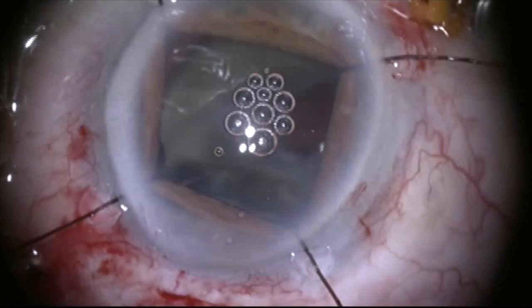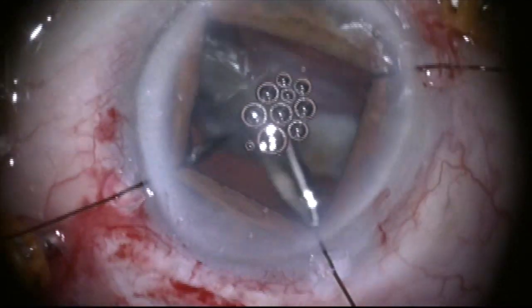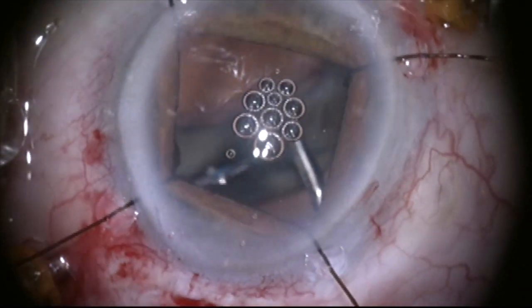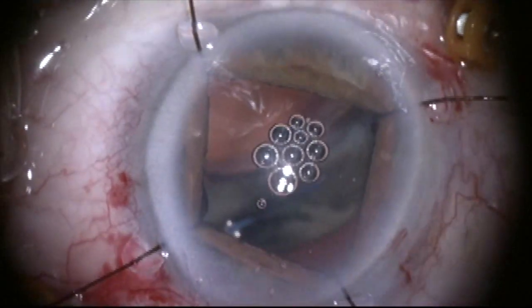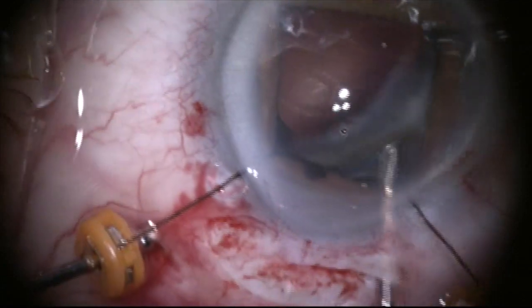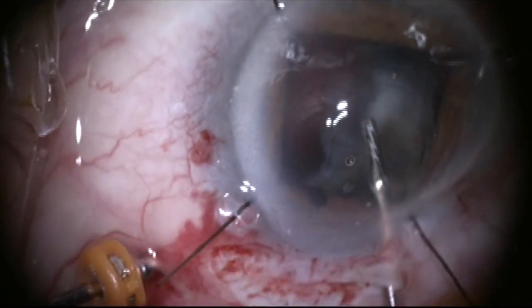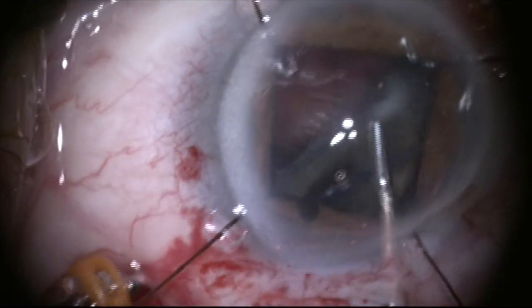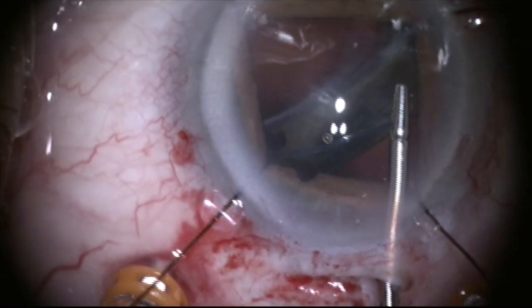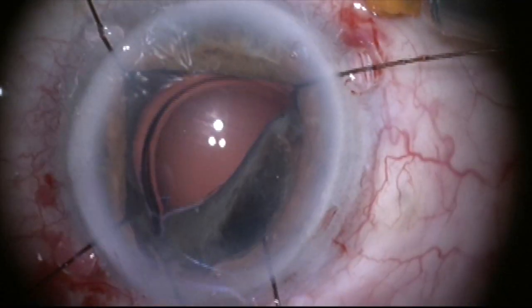There's a tremendous amount of very thick, dark Soemmering's ring material. This is really extraordinary. This lens looked almost like a placenta bringing it forward, and it's quite difficult to work with something this big. I'm going to go through my 6mm scleral tunnel and try to grab the optic, but my iris retractor in the lower right-hand corner is going to get in my way if I try to bring this up and out through the main incision.